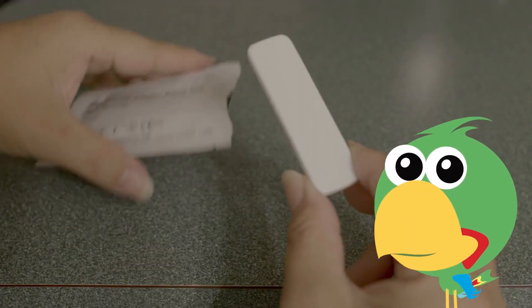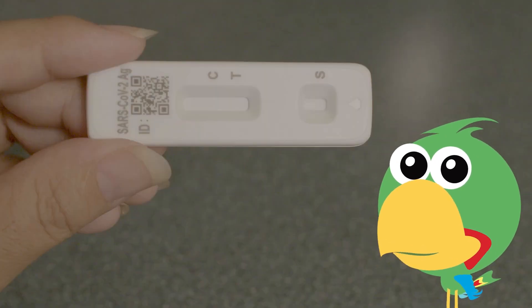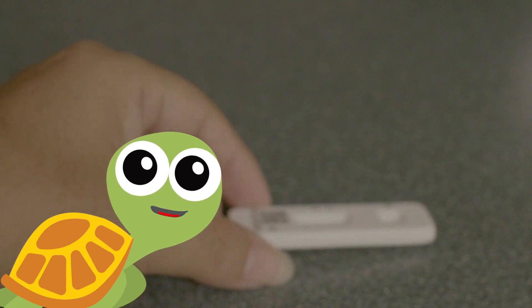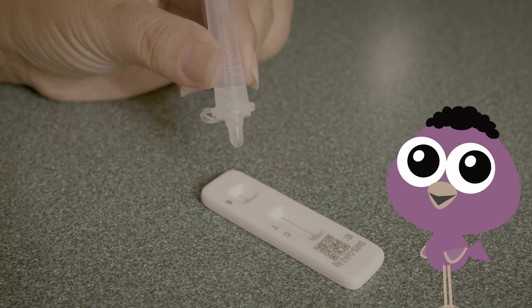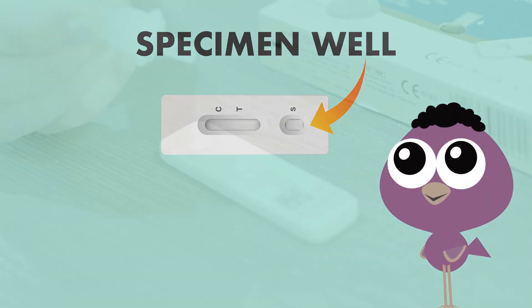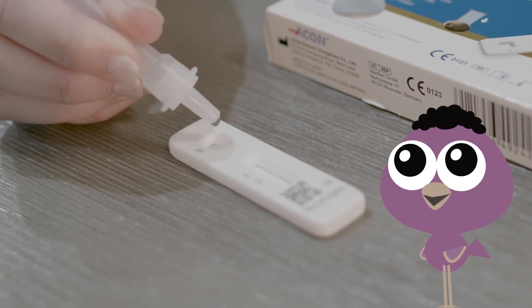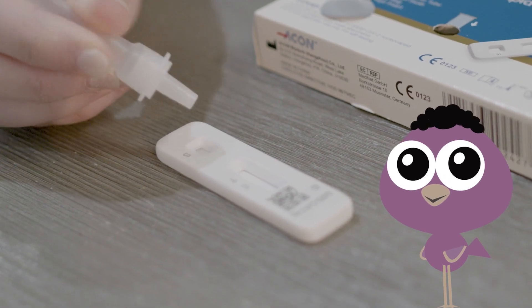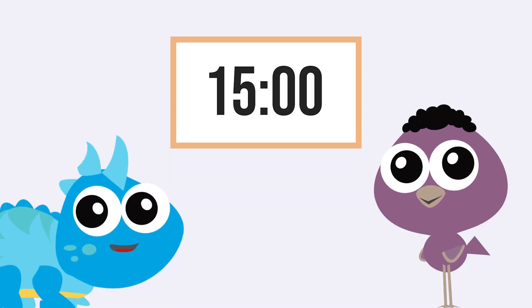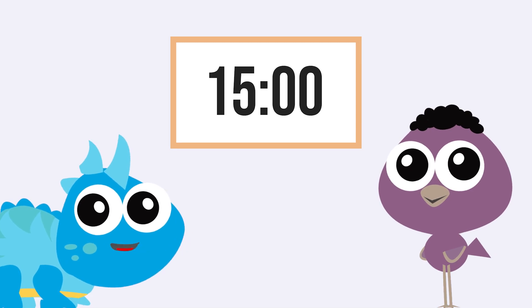Take the cassette — or as I call it, the rectangular results thingy — out of the pouch and lay it flat. Gently squeeze the tube and put four drops on the specimen well, like this. Easy peasy! Almost there — now just set the timer for 15 to 30 minutes and wait for the results.